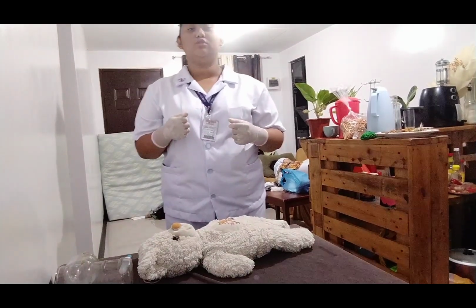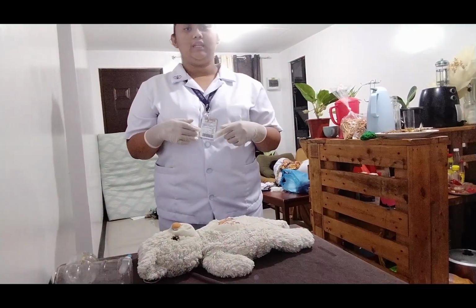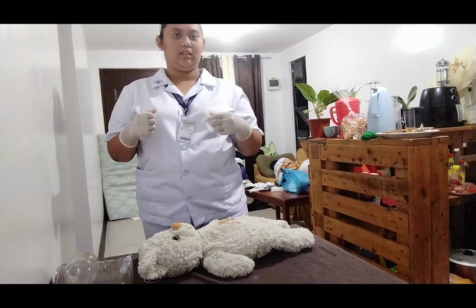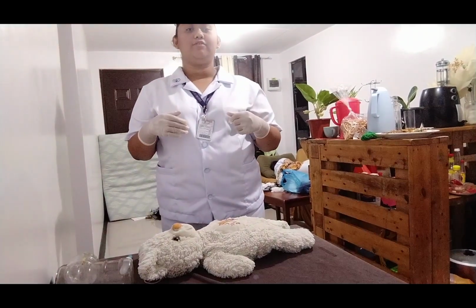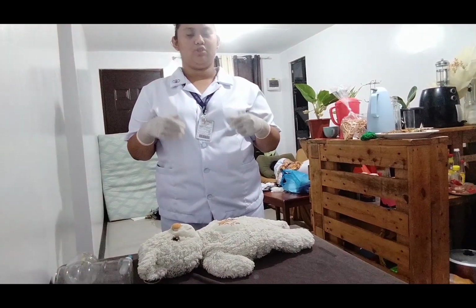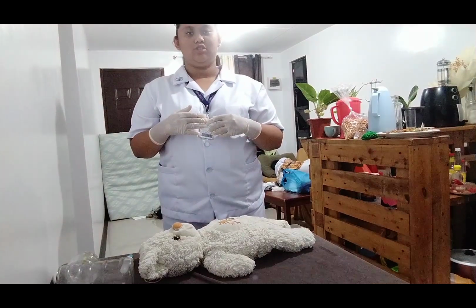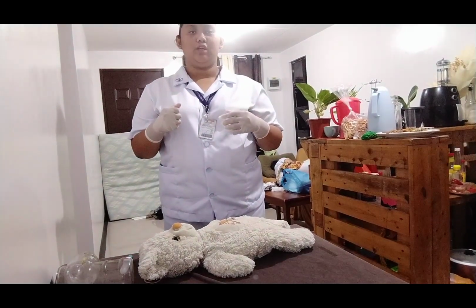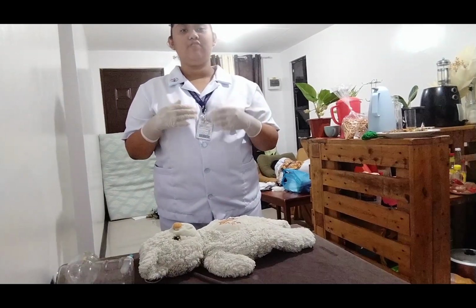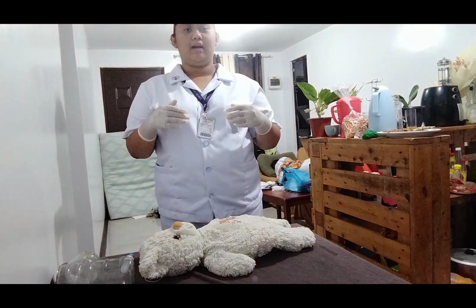After that, we can also do the head lift and chin lift to still open the baby's airway, and since the baby did not respond to stimulus a while ago, we'll have to perform the positive pressure ventilation, or the PPV. There are two types of positive pressure ventilation. It could be invasive, which is through the use of a ventilator, or non-invasive, which is through the use of the pediatric bag valve mask.